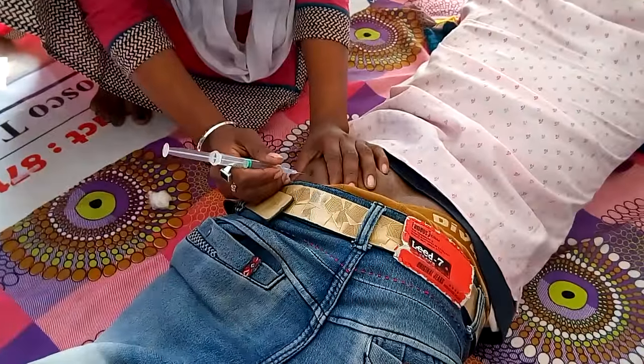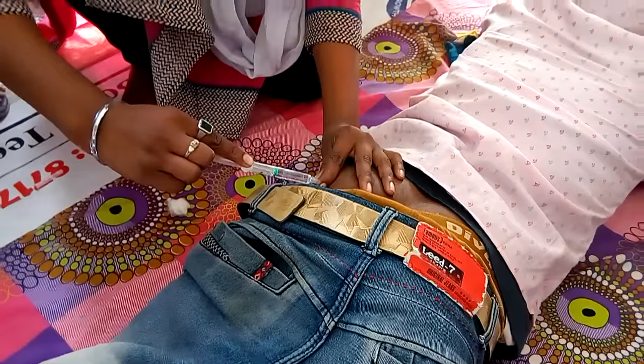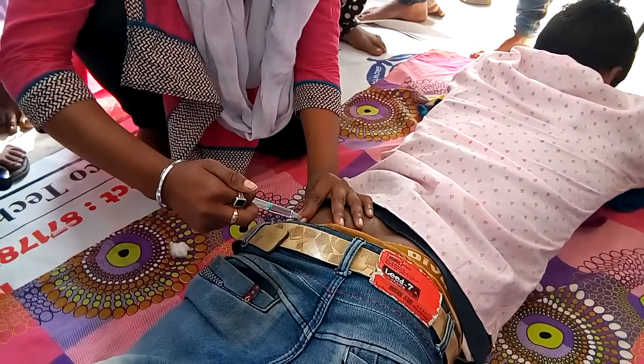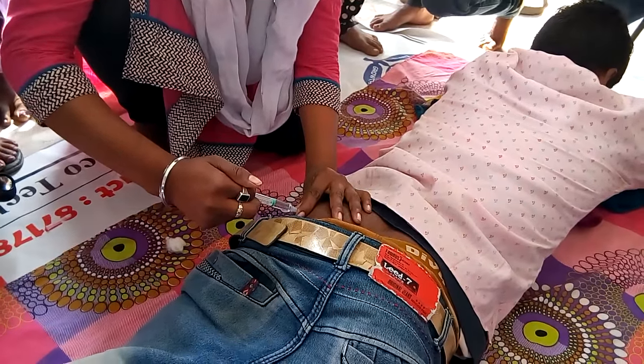This is 90 degrees. Let's see if the blade is coming. Yes. We have to push it a little. We don't want to push it too much — we want to push it just a little.